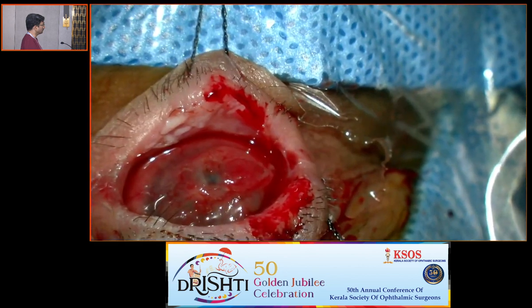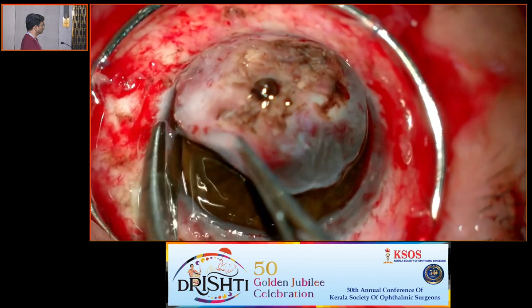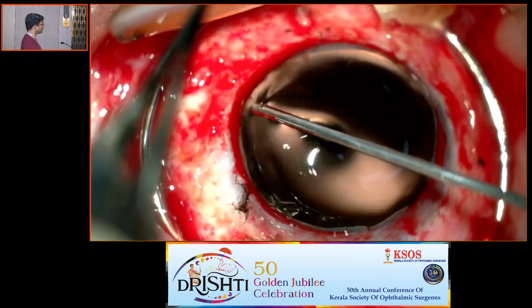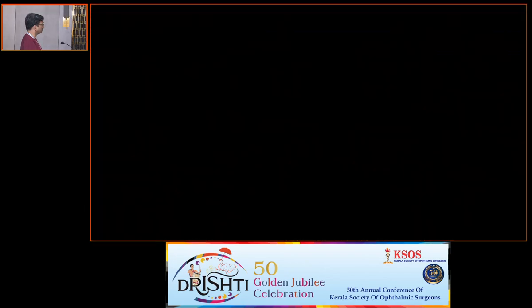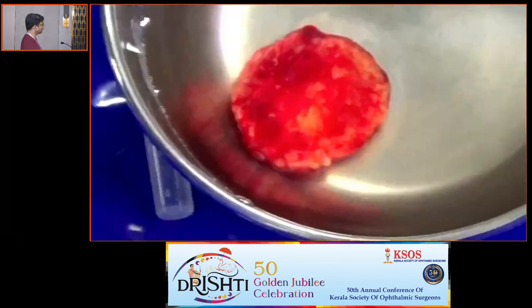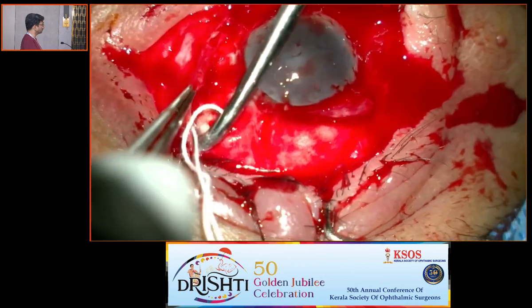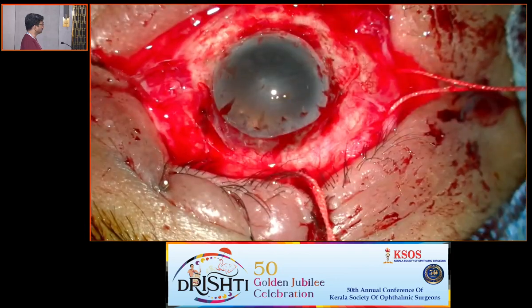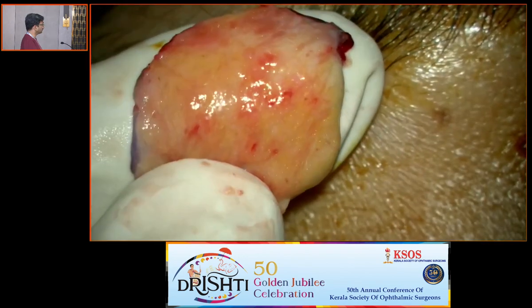Initial stage, stage 1A, is a preparatory stage. Corneal transplantation to replace the damaged cornea along with removal of iris and lens is done. Retina and optic nerve are examined intraoperatively and the eye surface is totally closed. In stage 1B, buccal mucosa of 3 cm diameter is harvested from the cheek. Following dissection of the ocular surface to bare the cornea and sclera up to the insertion of the recti muscles, the buccal mucosa is used to cover the ocular surface.